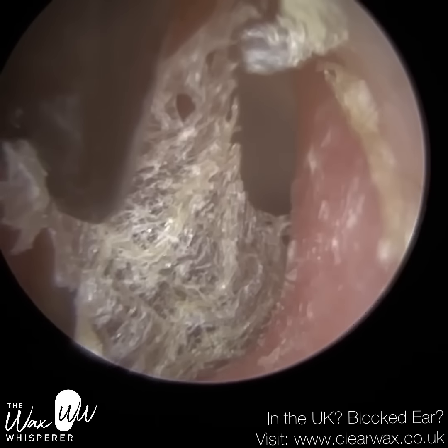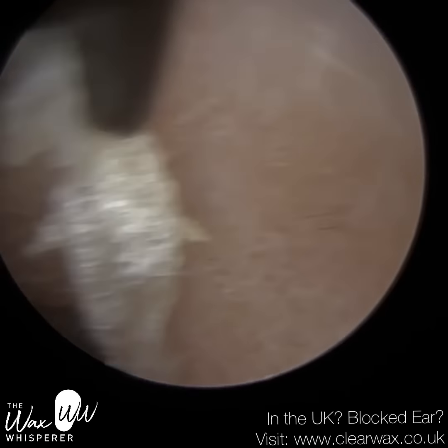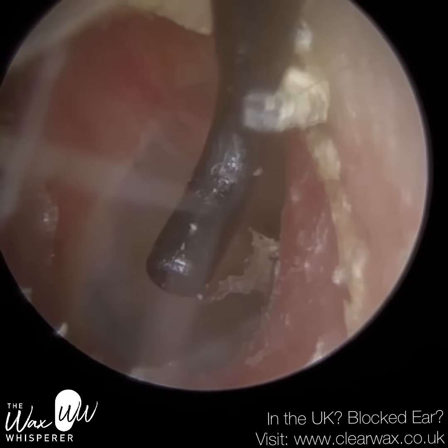You can see all that skin. You can see the texture of the skin, the structure of the skin cells. And that came out in a large sheet. There's a bit of skin a bit deeper in the ear. We're going to leave that. I'm not too concerned by that.